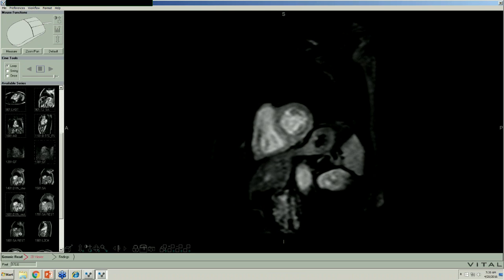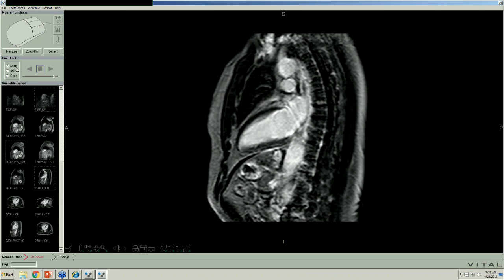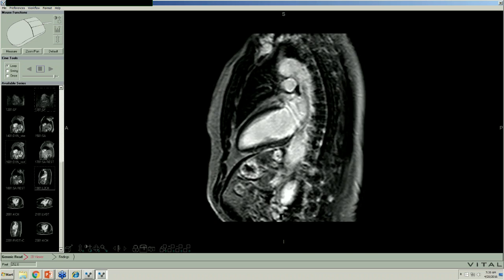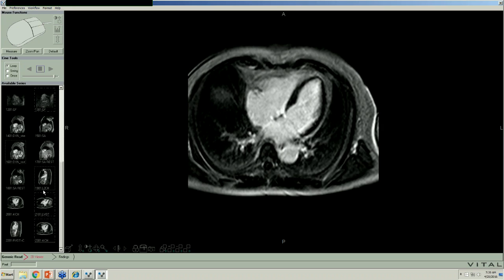We could actually color code this for you, and maybe we'll do that next time. We have some software for that. Makes it easier to perceive. You have it color coded. And so it looks like multi-vessel coronary artery disease when you look at that. This is looking for scar. And so this is supposed to be very densely black all the way around, which it is. This is called late gadolinium enhancement, and there is no scar. And so there's never been a cardiac event, no scar all the way around here. Any way we look at it, and no scar in there at all either. And we had some perfusion defects. So let's go on.